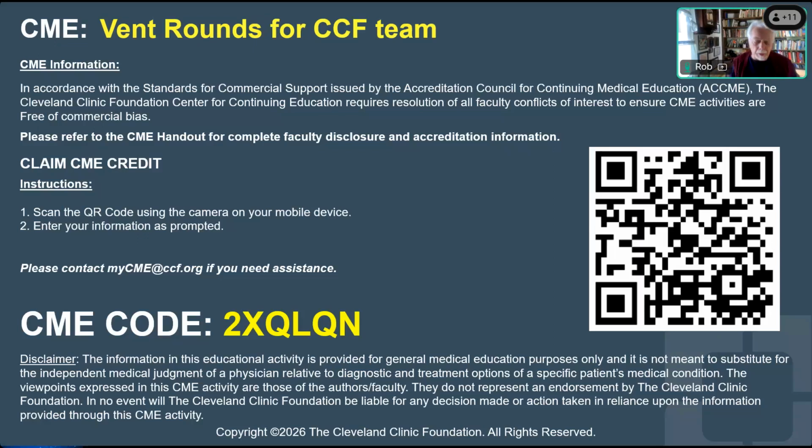IMT Medical just came out with an Alveo patient ventilator simulator. It's basically a relatively small hardware device. You connect it to a real ventilator, and you can get blood gases. I don't think it has a volumetric CO2, but you get indications of oxygenation and ventilation and even hemodynamics. So that is the ultimate simulator on the market that I am aware of right now that can be used with a real ventilator.